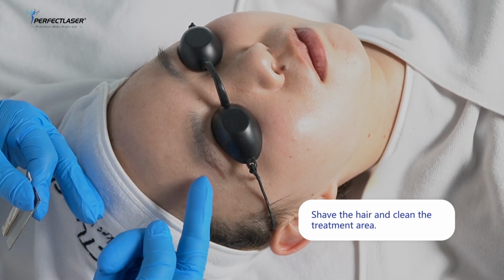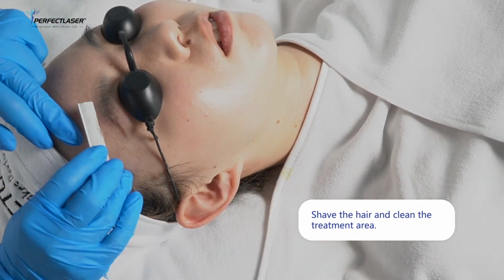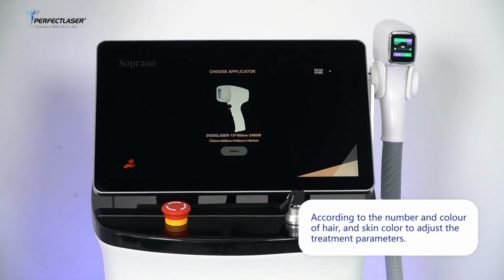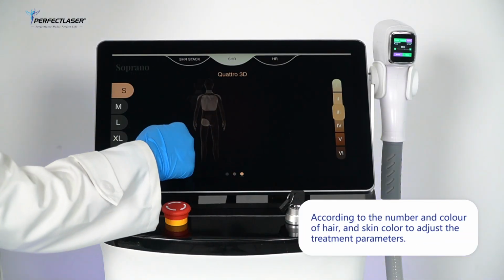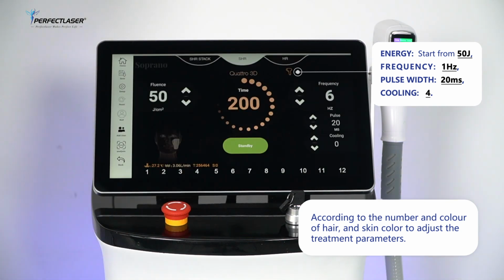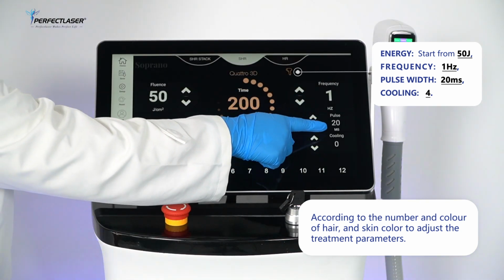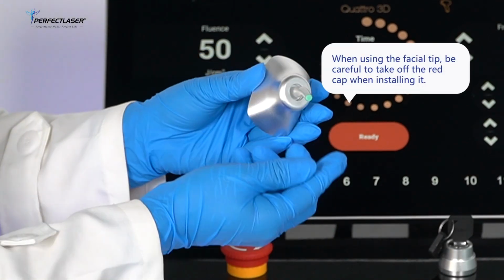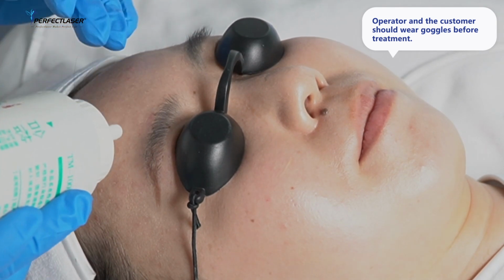Small area hair removal operation. First of all, shave the hair and clean the treatment area. According to the amount and color of hair and skin color, adjust the treatment parameters. Energy, start from 50 J. Frequency 1 Hz, pulse width 20 milliseconds, cooling 4. When using the facial tip, be careful to take off the red cap when installing it.